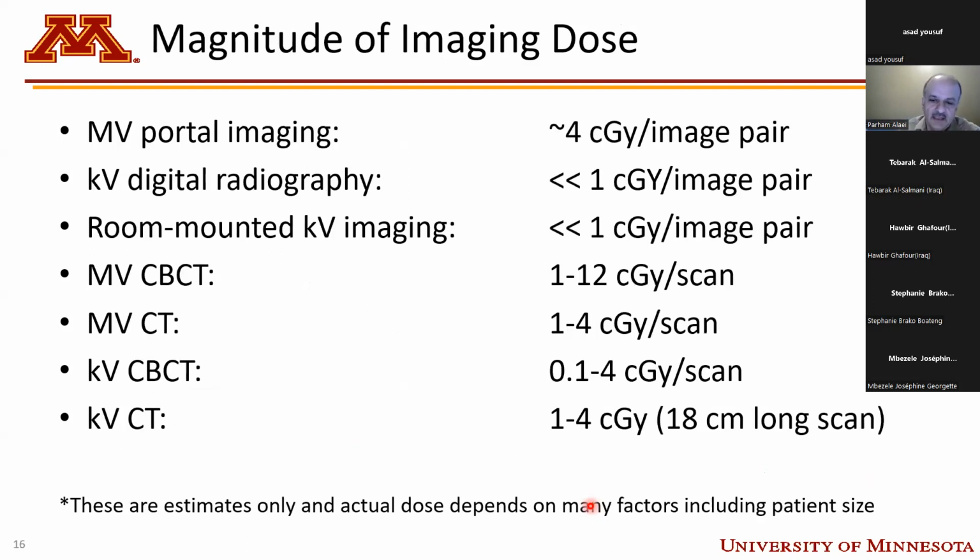So I have this slide, which I always show when somebody asks me, what is the magnitude of imaging dose from different modalities? So I put this slide together. Again, this is just an estimate. It's not a real patient dose, and many factors affect this.